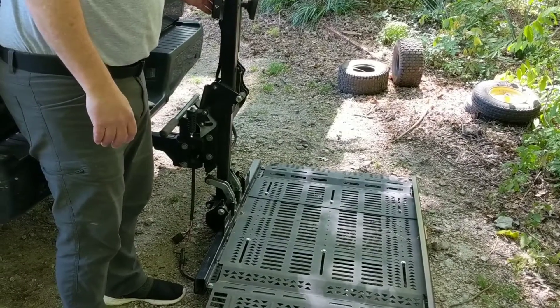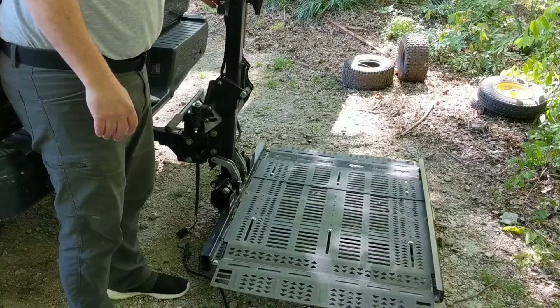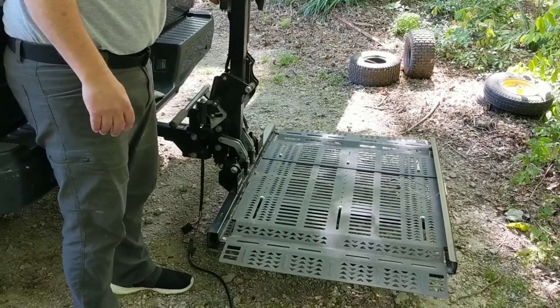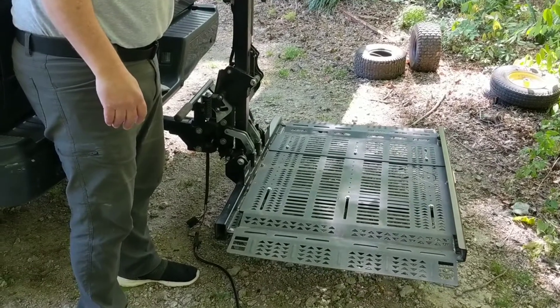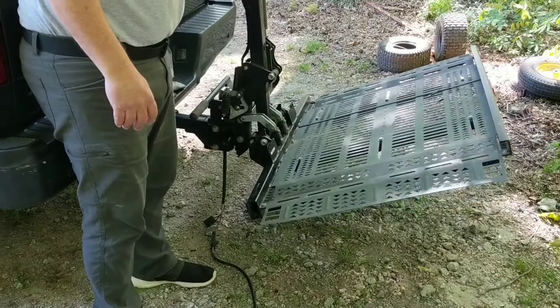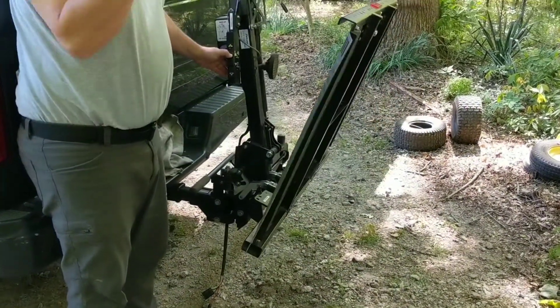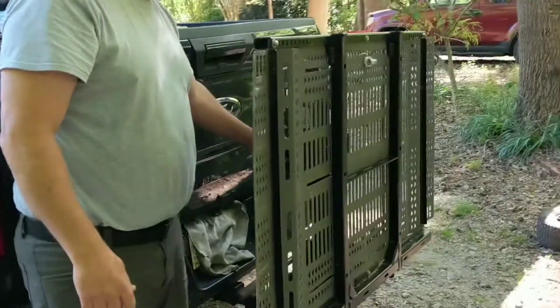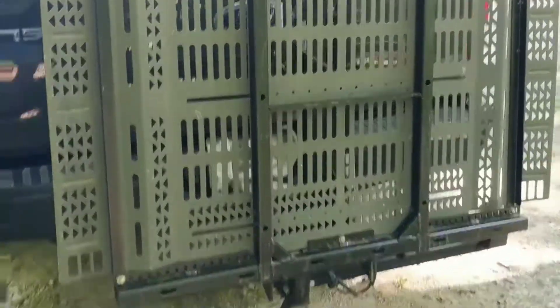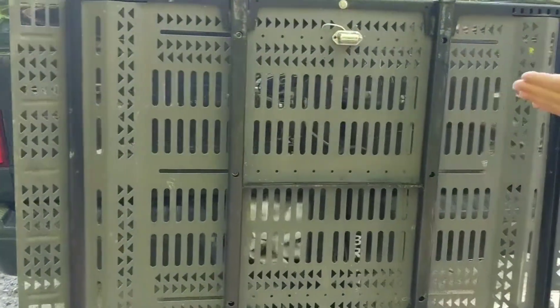Then just raise it back up. Of course when you have your scooter on there it won't fold up. That's really the gist of it — you can load it from either side.